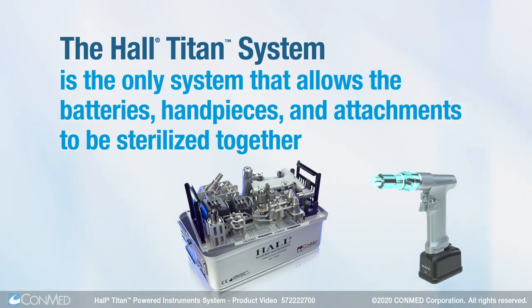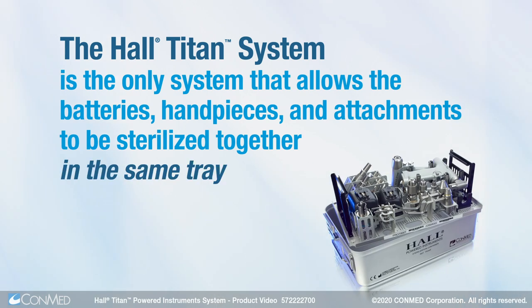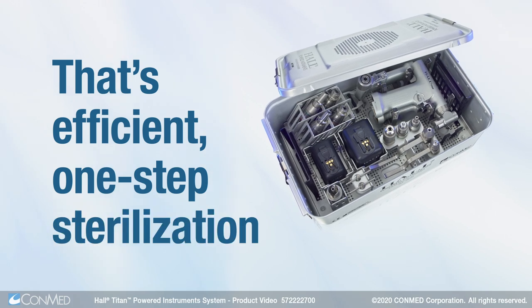The Hull Titan system is the only system that allows the batteries, hand pieces, and attachments to be sterilized together in the same tray at the same time. That's efficient one-step sterilization.